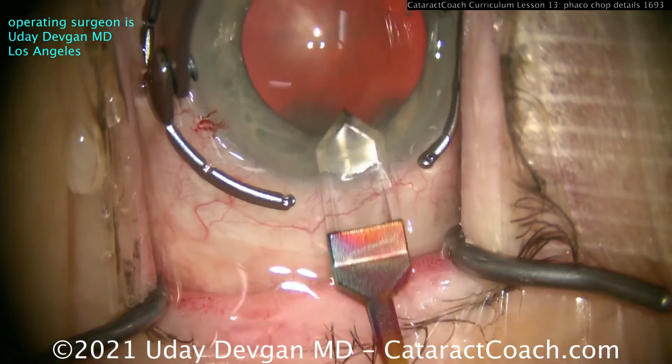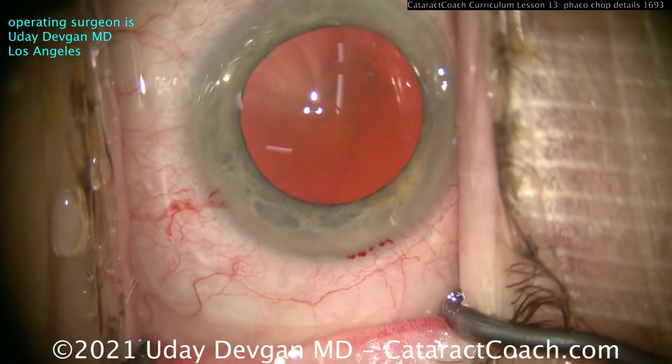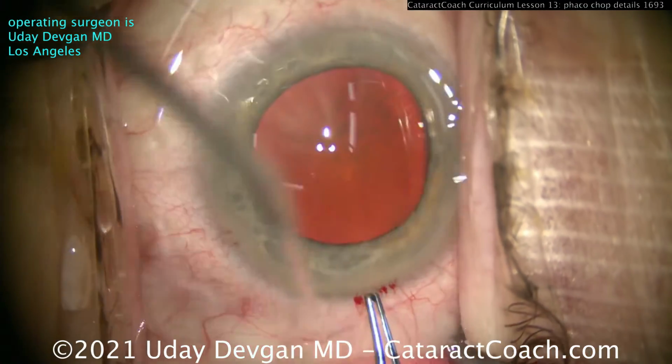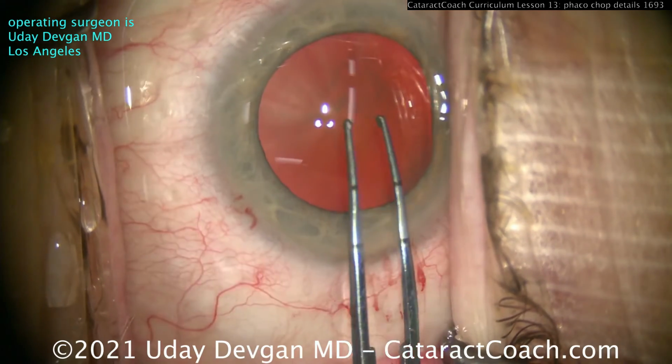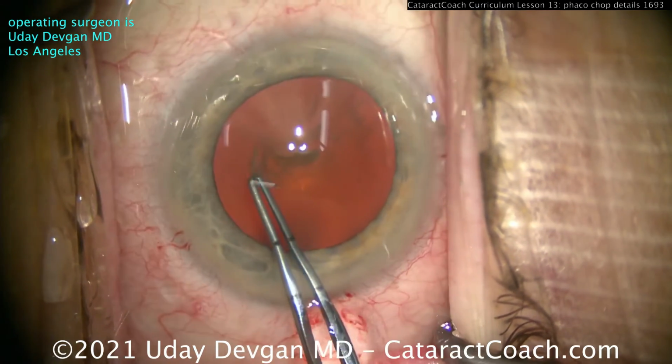This patient has a sufficient degree of nuclear density. This is about 3 to 4 plus nuclear density. So, incision looks good. I like the little bit of bleeding there at the limbus. That tells me that it's a good incision that's going to heal well in the long term.